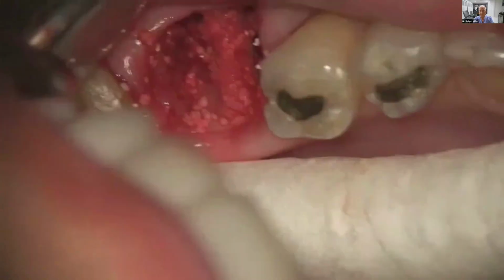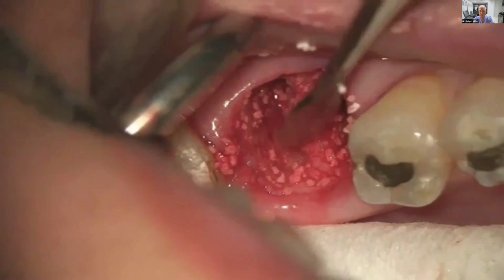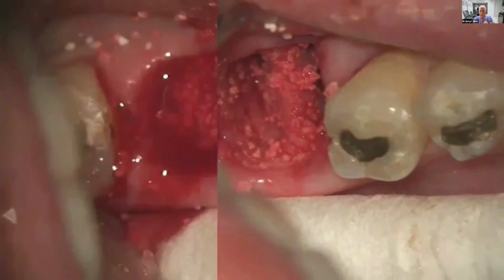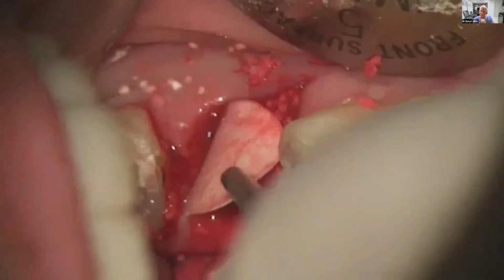You have to protect it. As soon as the patient closes, it'll be contaminated with saliva. The bone graft material will extravasate, and then you'll get salivary contamination. So after we fill this up with the bone graft material, what must we do?